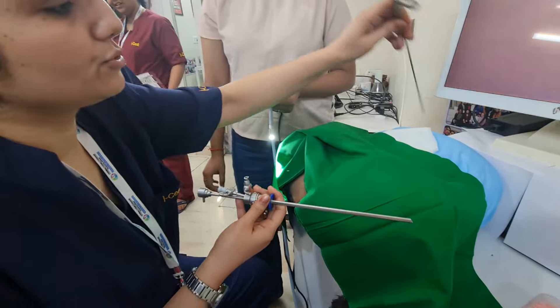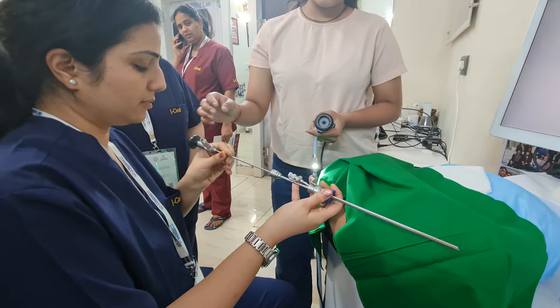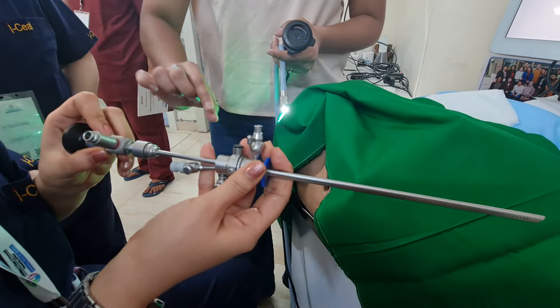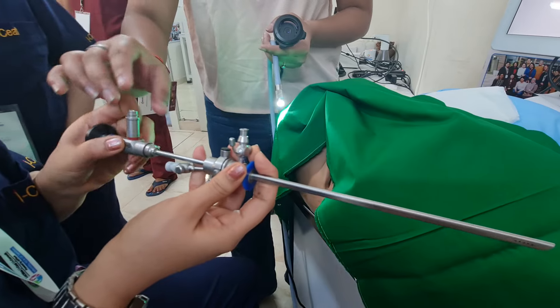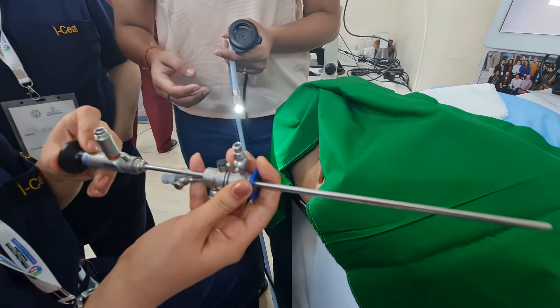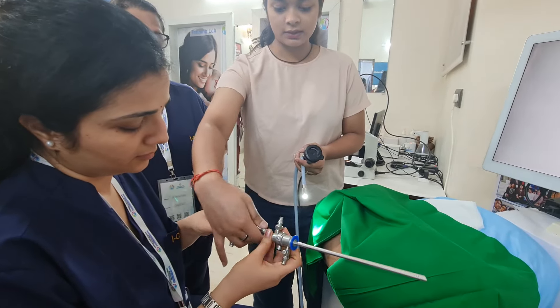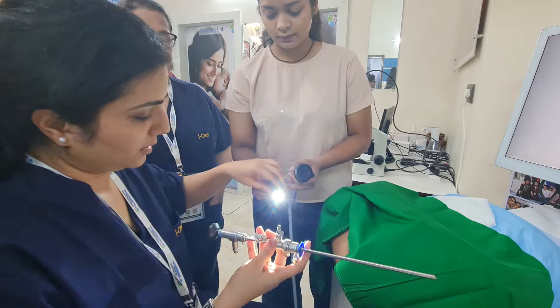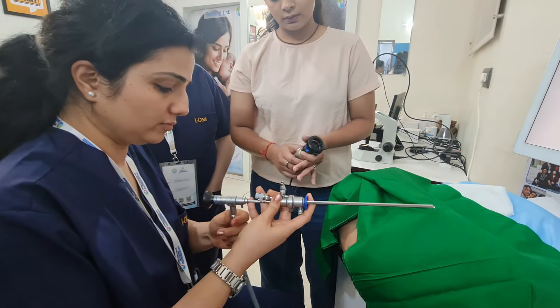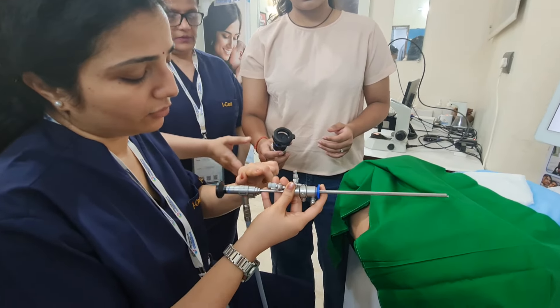Then this is the hysteroscope. Then you have to adjust the light source below. This is the channel for the inlet and this is the channel for the instrument.